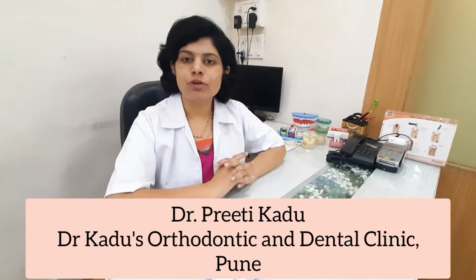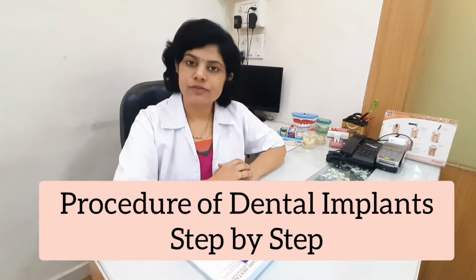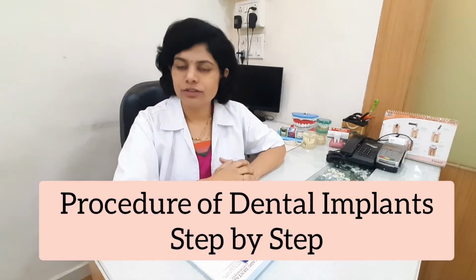Today I am going to discuss the dental implants, the procedure of the dental implants, step by step. As we have already discussed in our last video, the cases in which the dental implant can be done. For example, if there is any missing tooth, a single missing tooth or multiple missing teeth, or as in old age, all the teeth are missing and we want to put a fixed denture, in all such cases, the dental implant will be advisable.